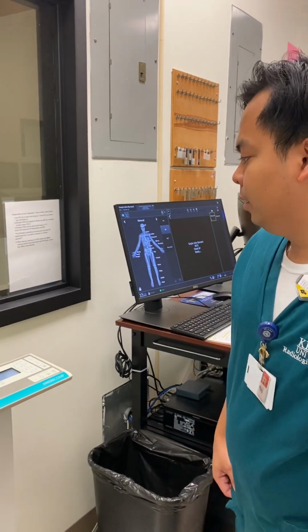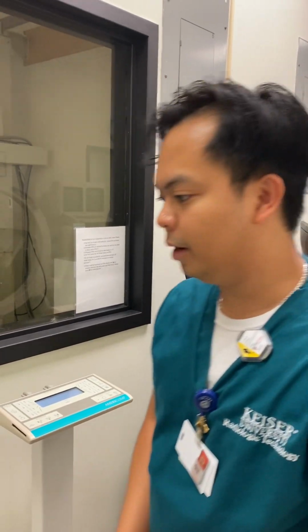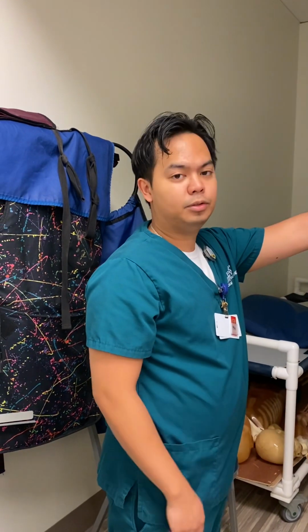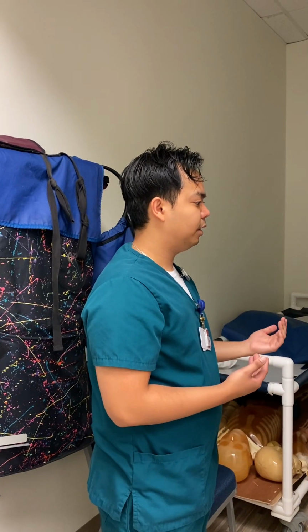And you'll tell the patient to then start breathing again. So tell the patient, you can relax, you can start breathing again, and then move the tube away from them so they can't hit the tube, and have them sit up, stand up.